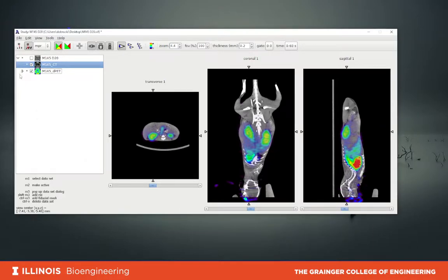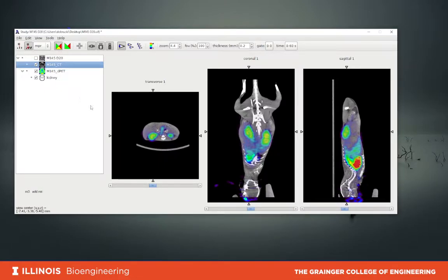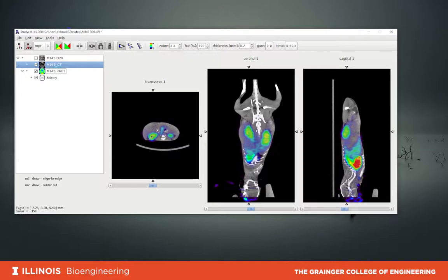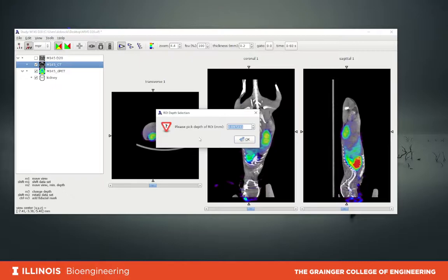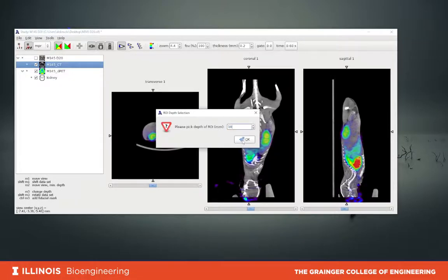Now we can see a triangle over here. When we click it, it shows we have a region of interest defined but not yet completely. We need to specify where this region of interest will be. The mouse cursor changed to a right-pointing arrow, so we can click in the middle of the kidney image using the transverse cut. This defines where we start the cylinder, and it will ask for the depth in millimeters. Since this is a mouse, the kidney will be less than one centimeter, so less than 10 millimeters — let's select 10 millimeters. Click OK.